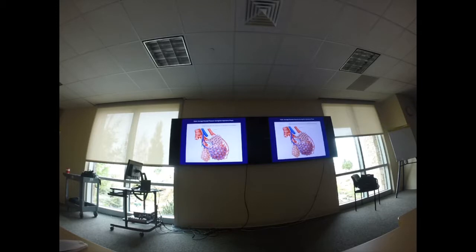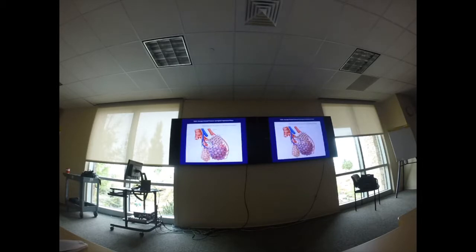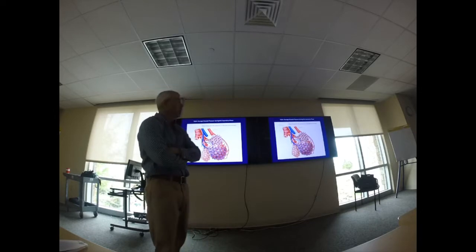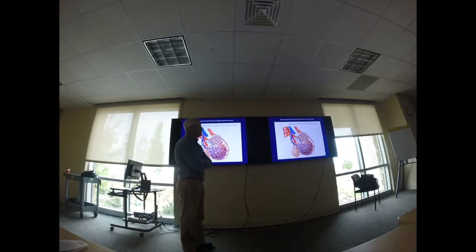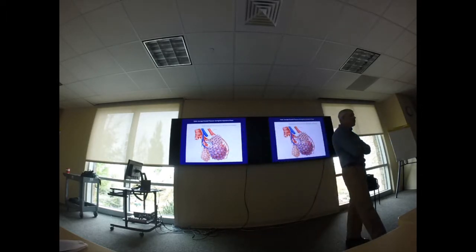Mark, you said a stiff lung, right? So this is the parameter that I'm really looking at in a few different patients that I'm concerned about having pressure in the terminal airways. So who would those patients be? I mean, where am I really concerned about my plateau pressure? I mean, honestly, I'm trying to get people to check a plateau pressure on every patient that is intubated, and I'll show you guys how to do that in our lab. I think it's important to check it and document it in every intubated patient.